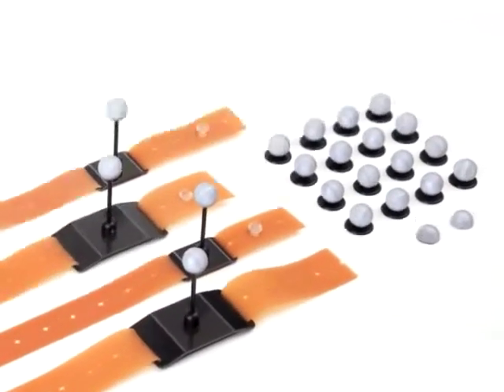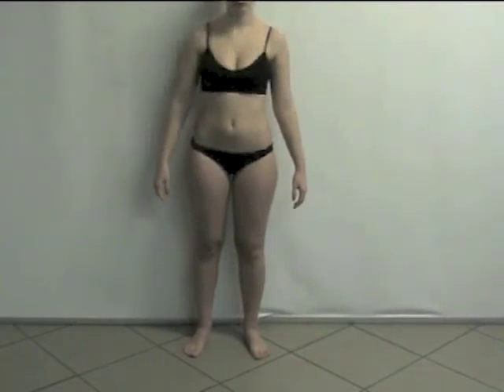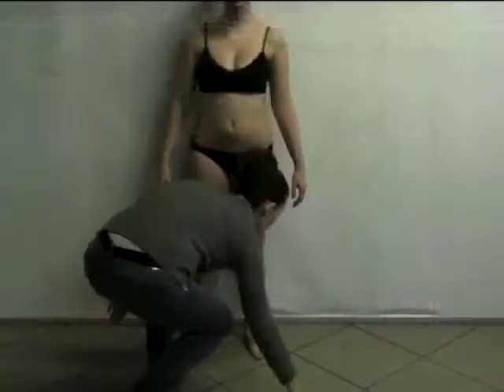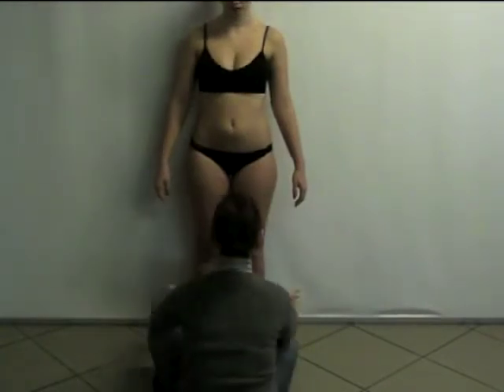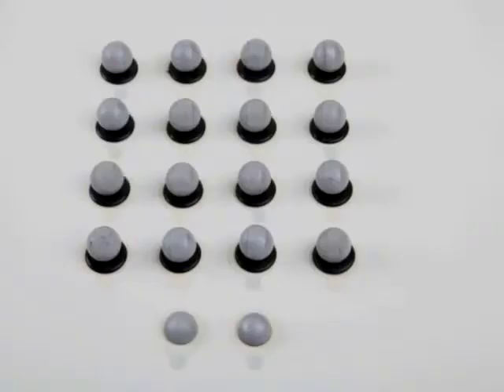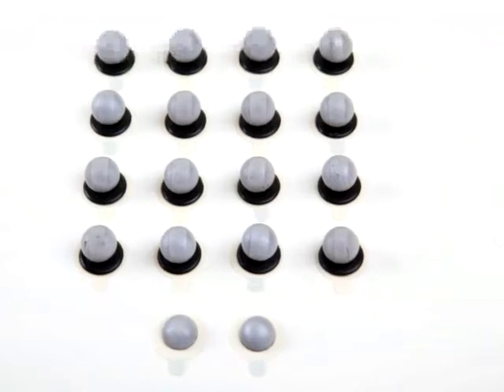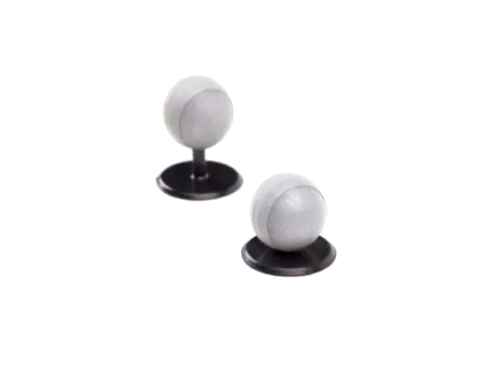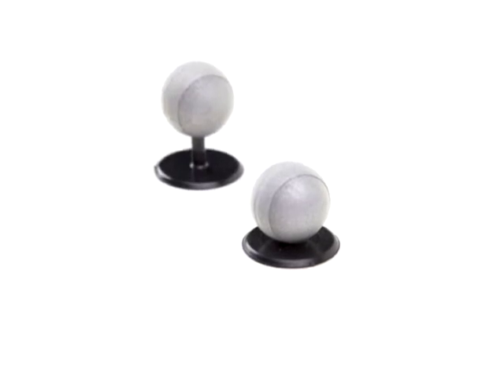Now we are ready to start with the placement of the markers. The preparation has to be performed with the patient in standing position. You must never apply the markers on one side before the other, but apply them in a symmetric way — one on the right and one on the left — from the distal point, which is the lowest one, up to the proximal point, which is the highest one. The operator must be only one person. I suggest sitting down in front of the patient. It's important to have already prepared the markers with the tape under the black base of the small support. If you have the support with a long pin, you have to cut it so that the marker is perfectly attached to the base.